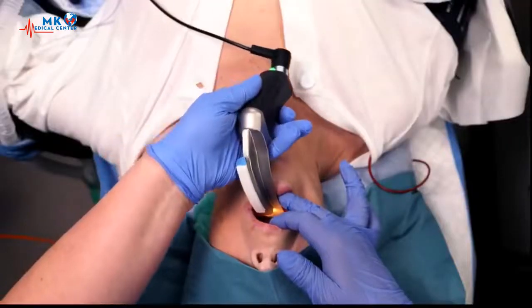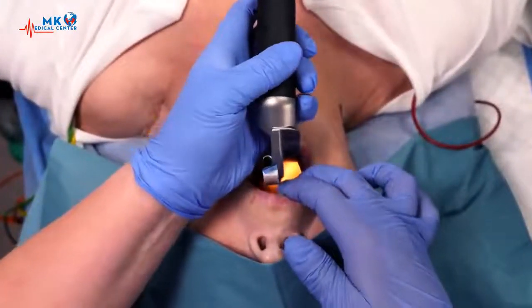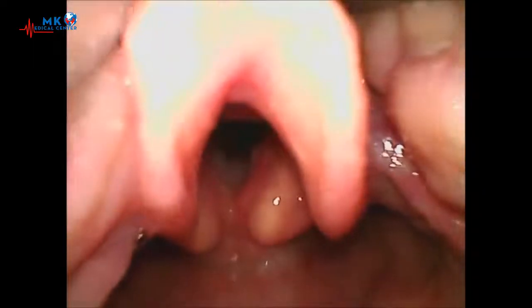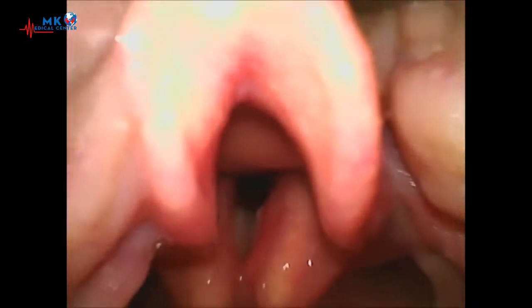Insert the blade in the right side of the mouth, carefully pushing the tongue aside. The aim is to create an unobstructed line of sight to the larynx by pushing the tongue to the left and lifting the epiglottis, exposing the vocal cords. This requires precision, not brute force.